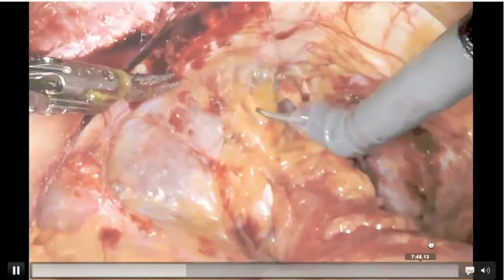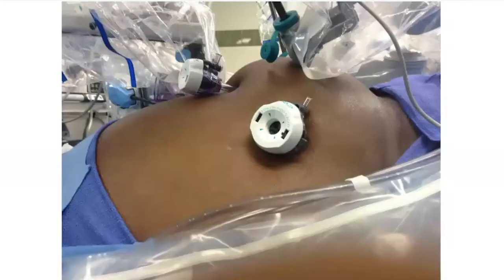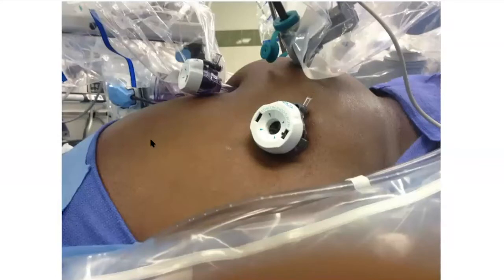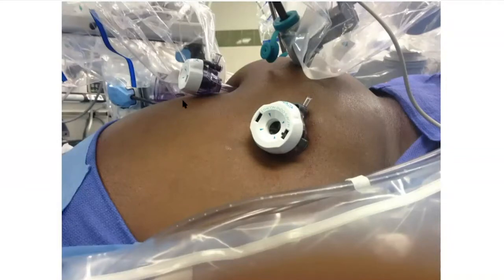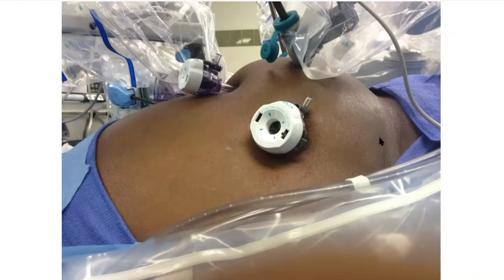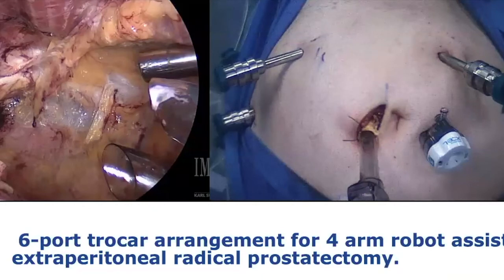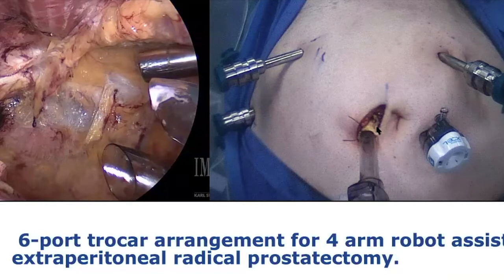The advantage of this approach is there is no bladder takedown — immediately you get to the fascia, you can open it and proceed with the procedure, so there is some time savings. This is what a typical look when you have the insufflation in the extraperitoneal space: if you have the abdominal cavity insufflating, you have significant bellowing making it difficult to work. This is a typical six-port trocar arrangement — you can see the inside view and outside view before exchanging for the XI.